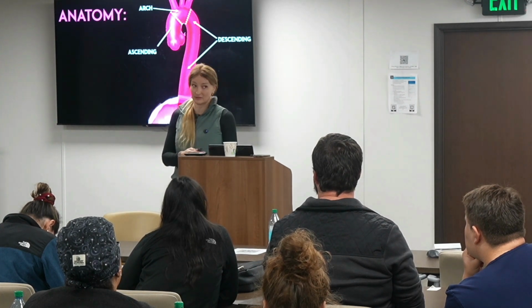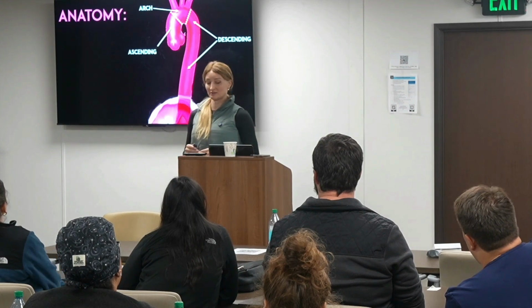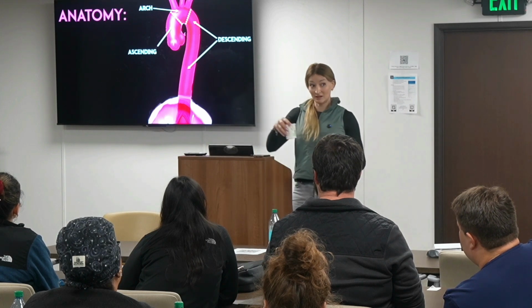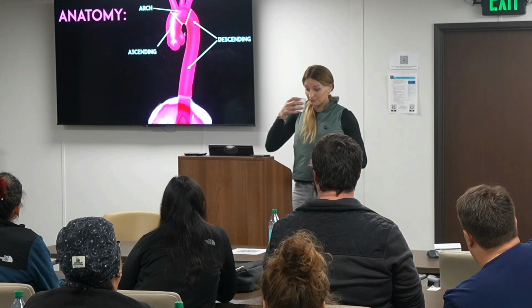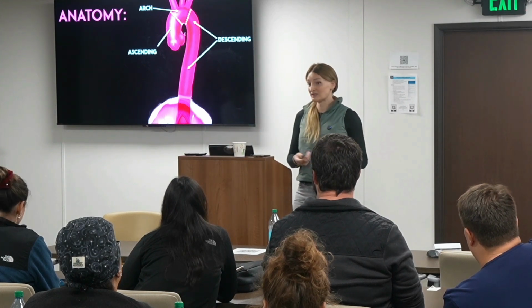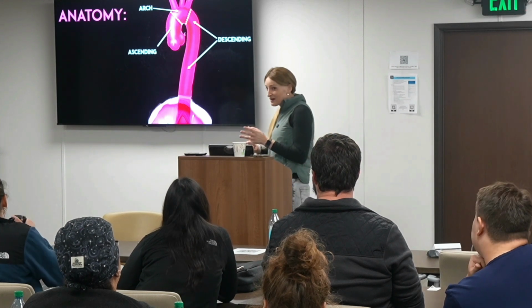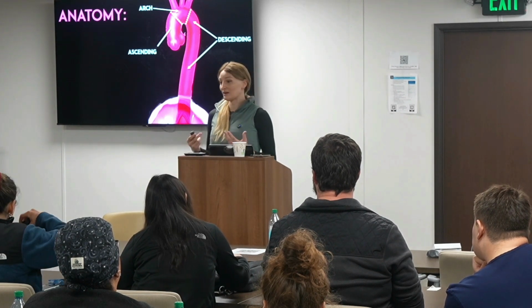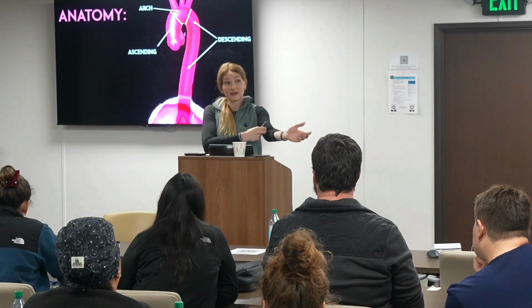and even if they need surgery. Now, in the abdominal aorta, what is abnormal as far as size? Like, when do we worry about it? Well, 6, we definitely worry about it. And it is abdominal aorta, not thoracic. 5 is like impending rupture, right? Greater than 3 is considered abnormal. Lower than 3, if it's 2.8, you might call it ectasia. The actual definition is 1.5 times normal, and that's actually a definition for any blood vessel when it's considered aneurysmal.